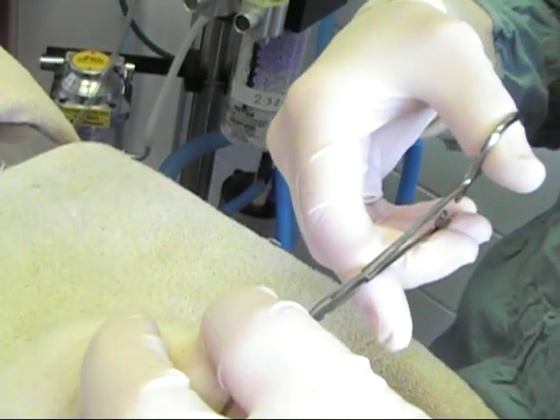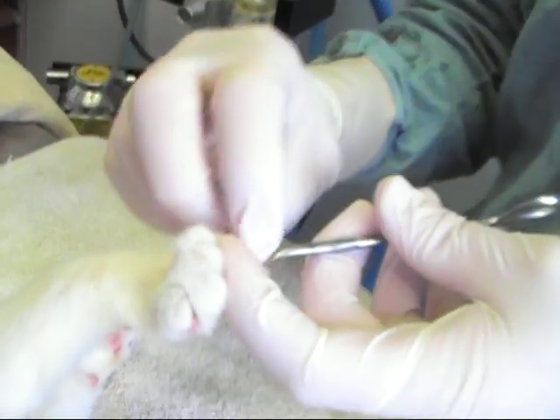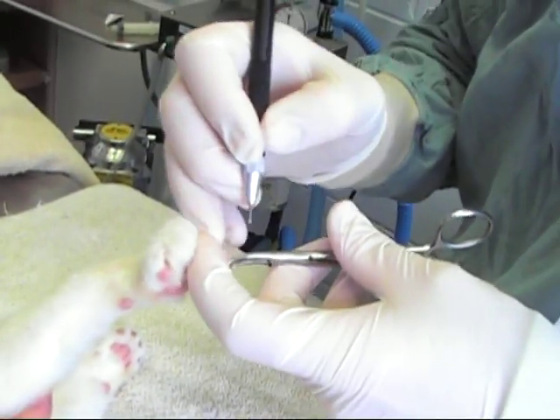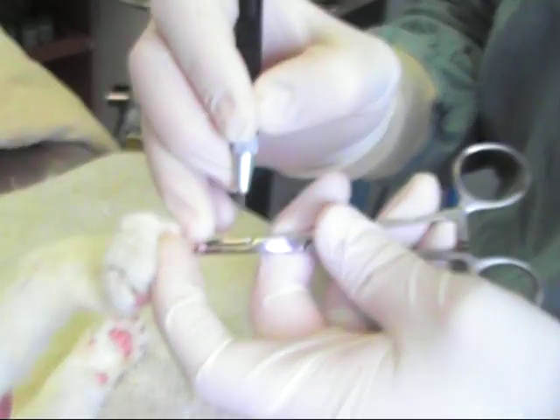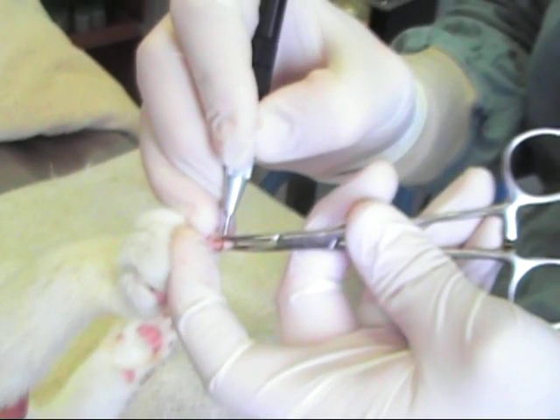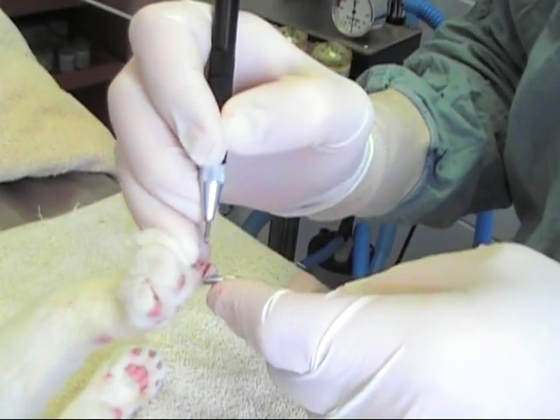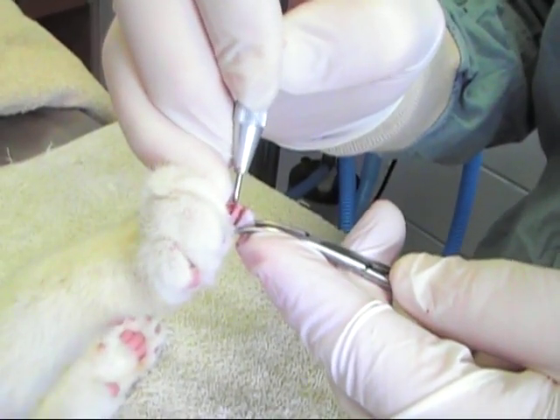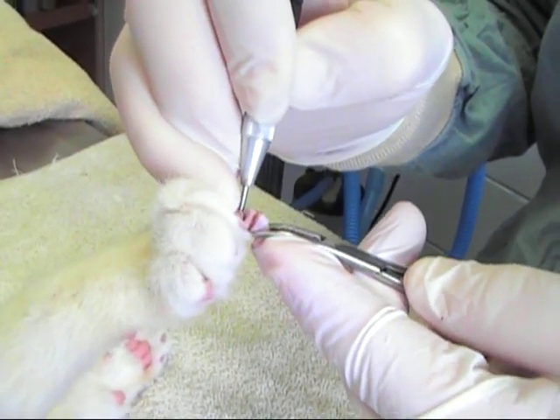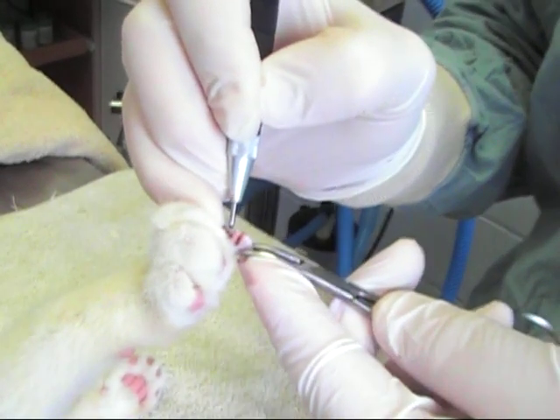Why don't you go ahead and show us this claw? I'm just using the hemostat to clamp down on the nail. That's the first incision. Locate the blood supply. A little incision over the nail here. Turn back a couple ligaments.